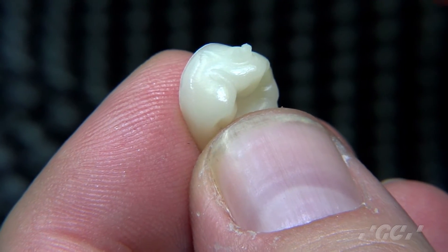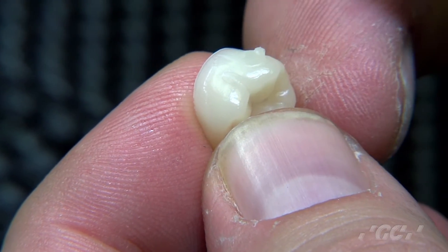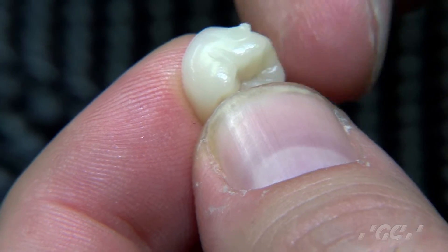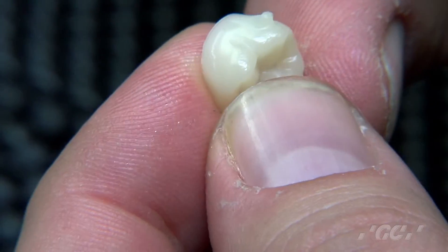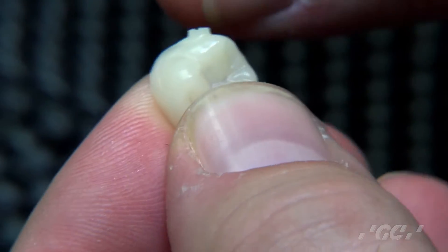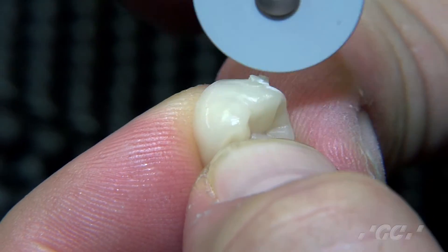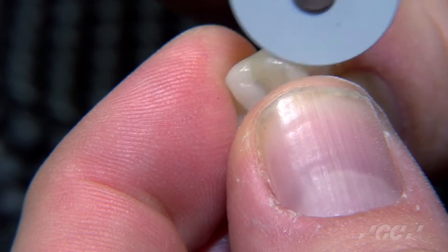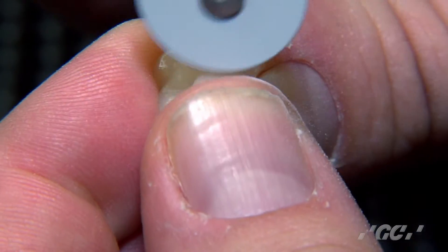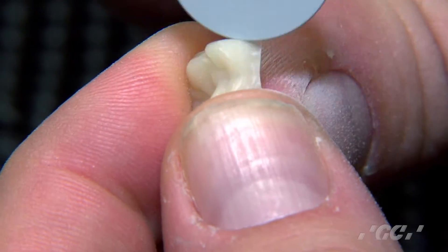We're going to take a gray semi-coarse rubber wheel. If you're using a rubber wheel for your high speed, you can also use cup-shaped rubber wheels or different types more applicable to your operatory. In this case, we're using a gray rubber wheel for a standard laboratory handpiece to remove the button on the restoration after it's milled. Then we go in a circular motion and take the same rubber wheel over the entire restoration to remove any burr marks the milling machine may have created.